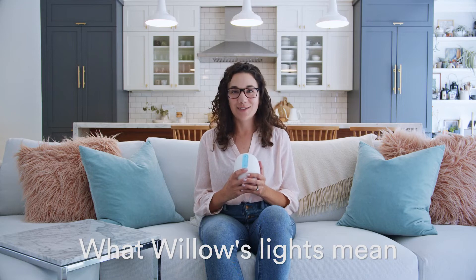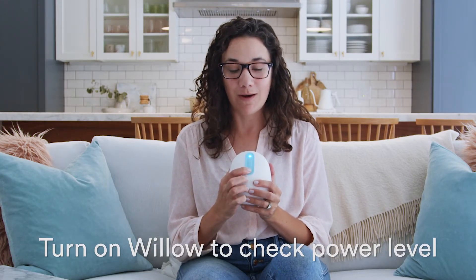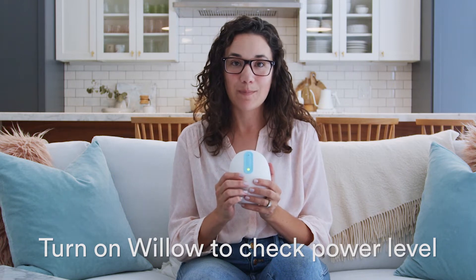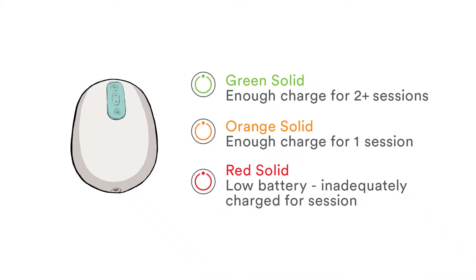Willow uses its lights to talk to you. First, power on your pump by pressing and holding the on-off button until the pump lights up. This LED tells you the pump's charge. It can be green, orange, or red.